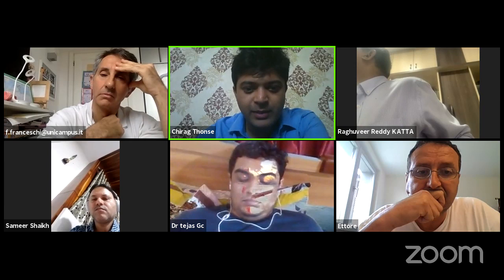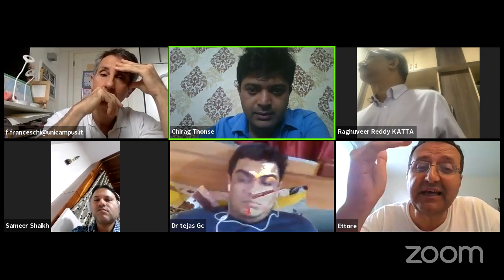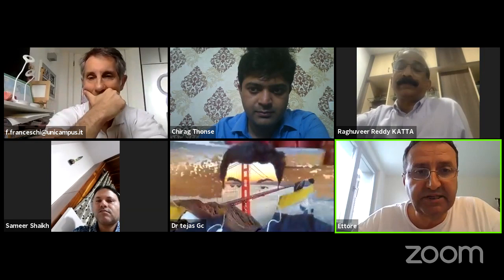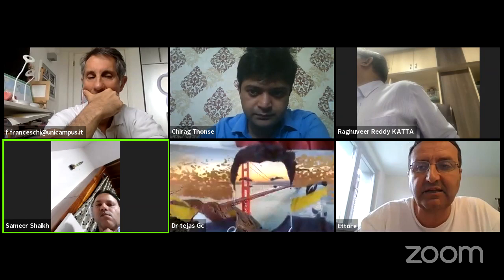It is, and if you don't mind, I have another talk and I will show the two techniques so you can see. Anyway, if I can tell you something, I don't want to be unkind. It's just that the arthroscopically assisted Latarjet, in my opinion, is the Latarjet that minimizes the risk of complications and improves at the best the precision. Because we do an arthroscopic part when we introduce the guide I developed for bone block, so creating double bony tunnels in the glenoid.